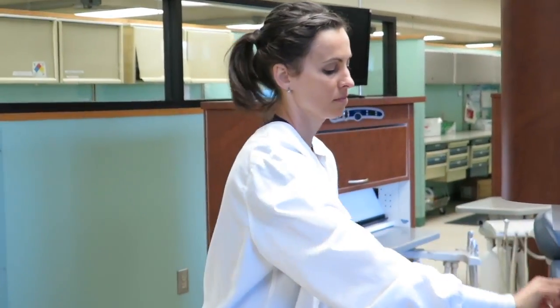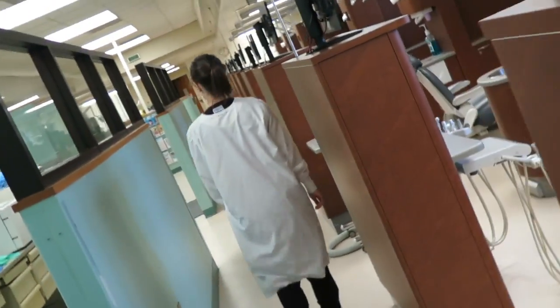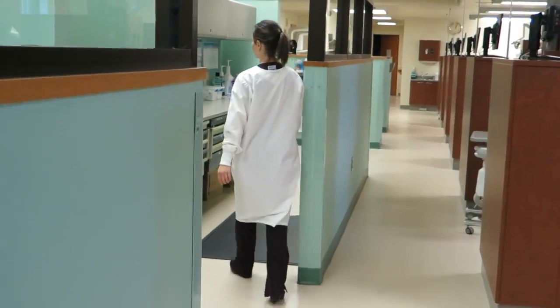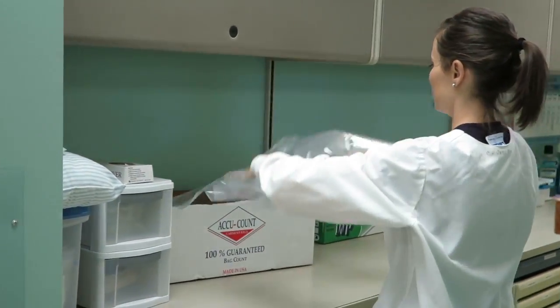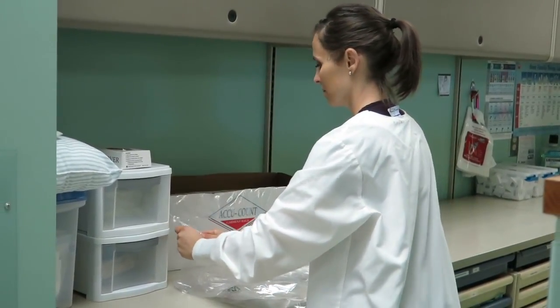Remove your mask, making sure to grab it by the ear loop and not the front of the mask. Next, we will get the barrier wraps from the clean area. Now that you have washed your hands, be sure not to touch anything on the way. This includes your hair or your face. Depending on your unit, and if you have additional mobile units that day, that will decide how many barriers you will need.